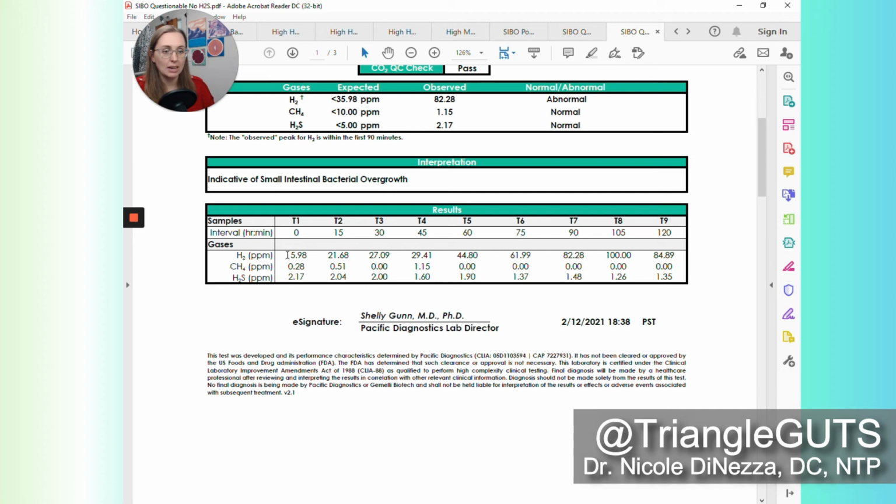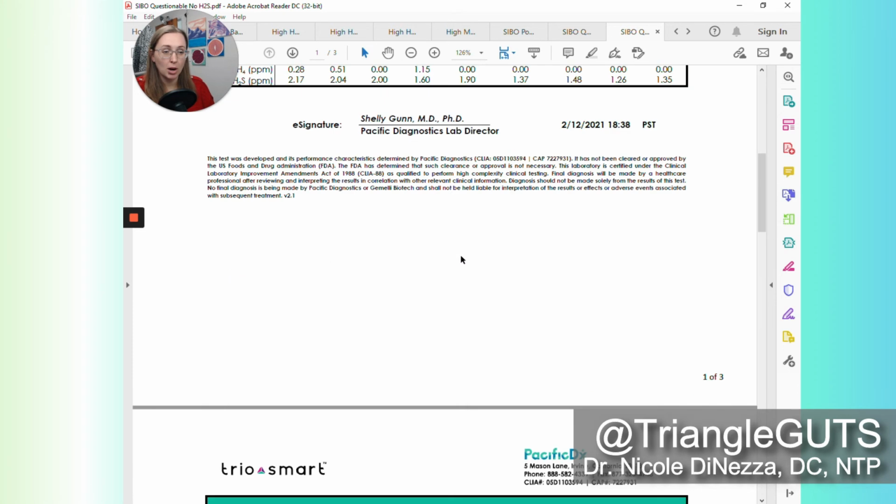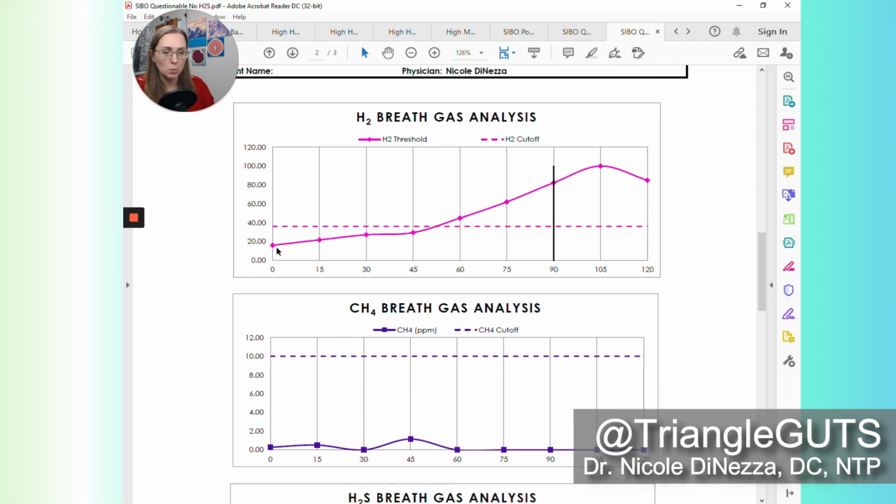It looks like, again, you get about a 30 parts per million rise between baseline and the 60-minute mark. And 60 minutes is right about where we need to be if we're using lactulose, which we are. And you can see it does look like the fermentation accelerates between 45 and 60 minutes. You can see the slope of the curve does change in that period of time. And then it looks like possibly starting at 45 minutes and then going up, up, up, we're starting to capture the beginning of colonic fermentation.